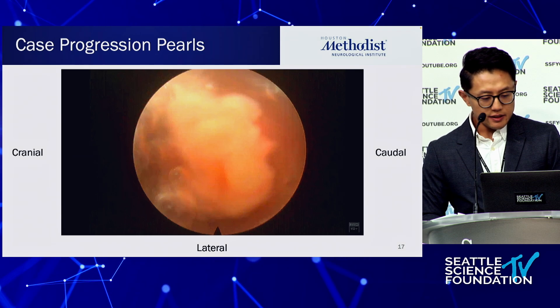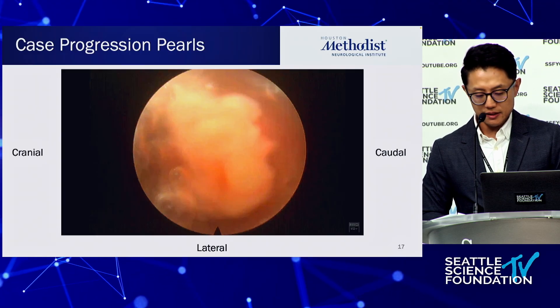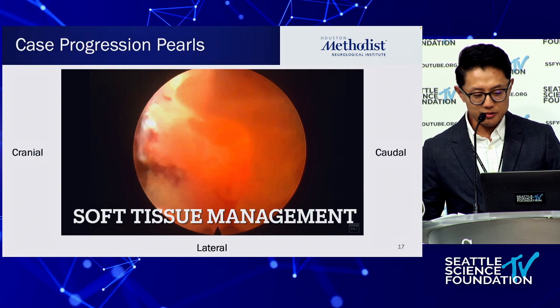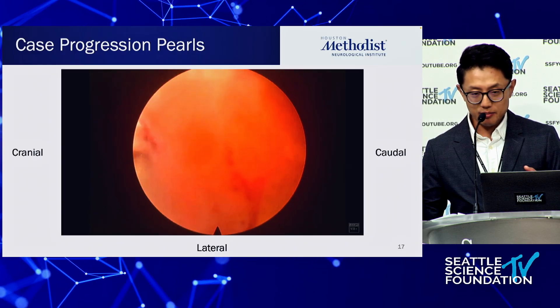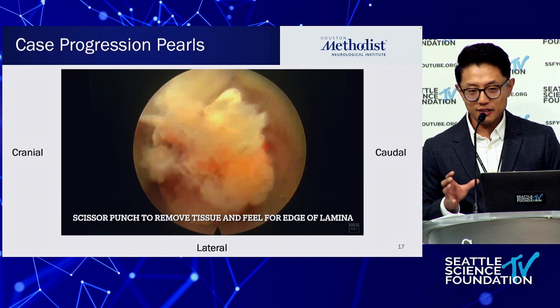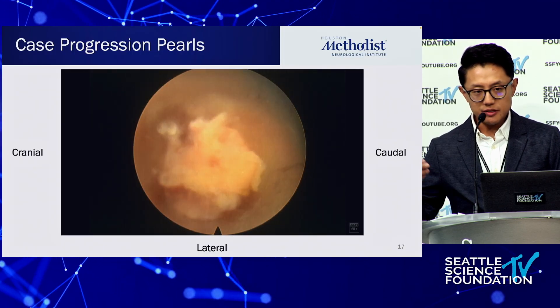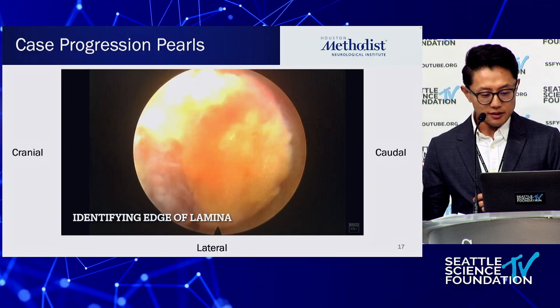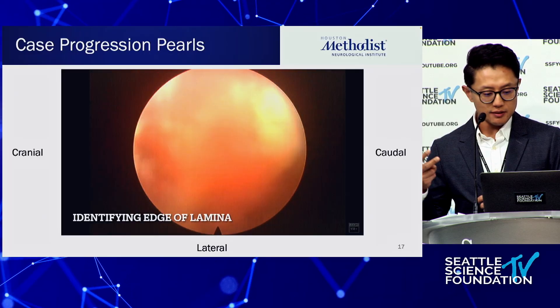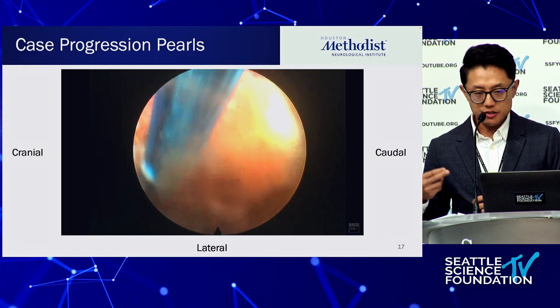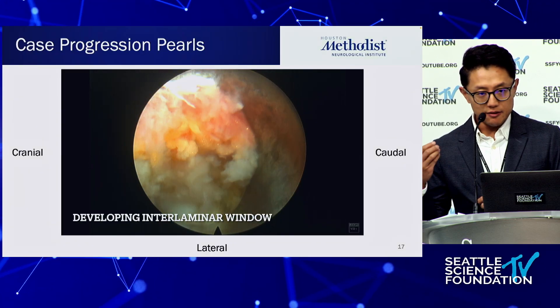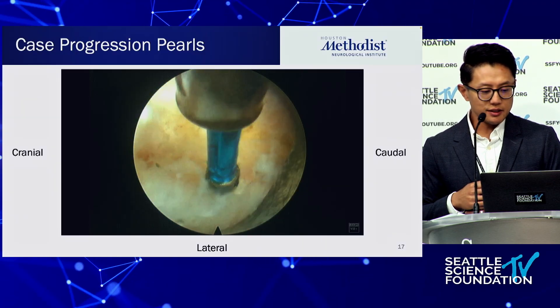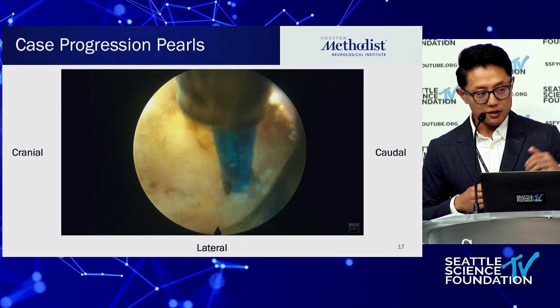Here are the progression pearls. This is left side, so cranial is to the left, caudal to the right, lateral at six o'clock. First, you have to deal with soft tissue — when you first put in the scope you just see this. Don't bring in your RF probe to shrink tissues; you'll spend 20 minutes and accomplish nothing. Instead, during dilator and cannula placement, maintain a stereotactic idea of where the bone is. Use a scissor punch or graspers to remove tissue quickly while palpating for the laminar edge.